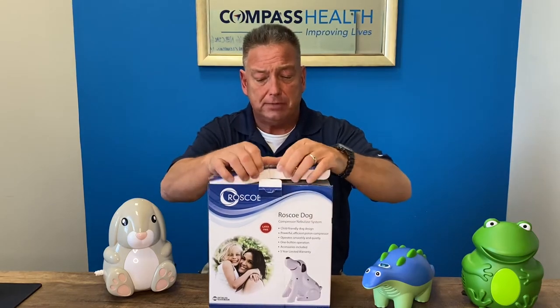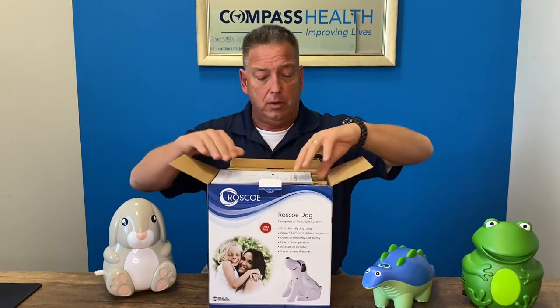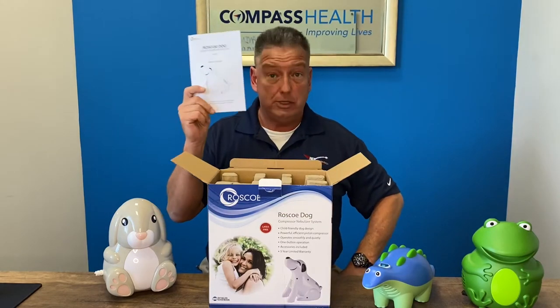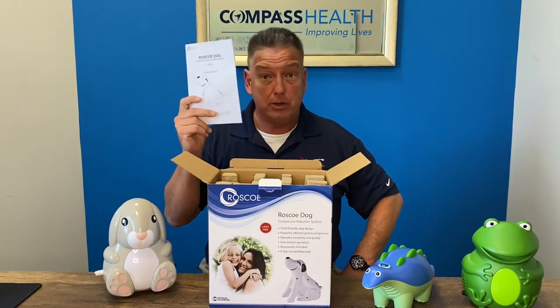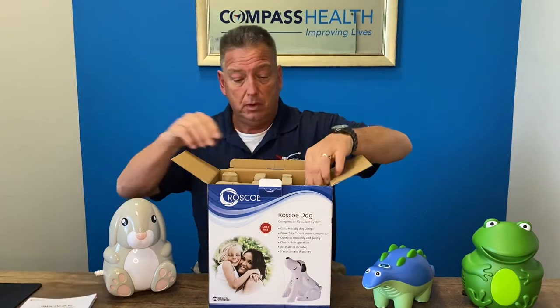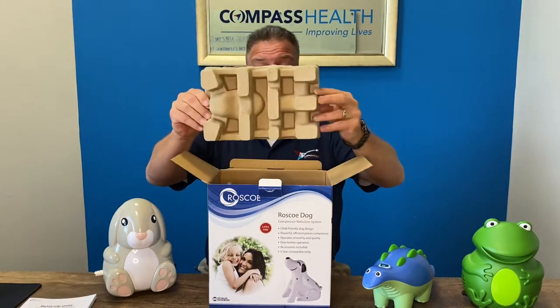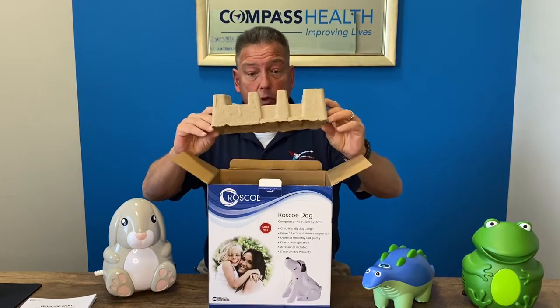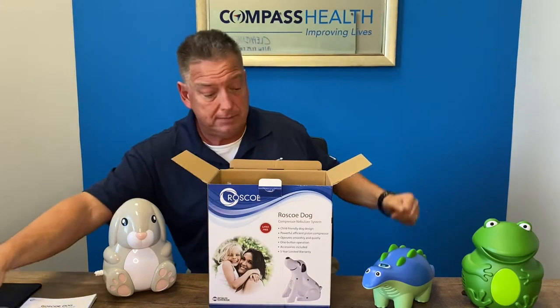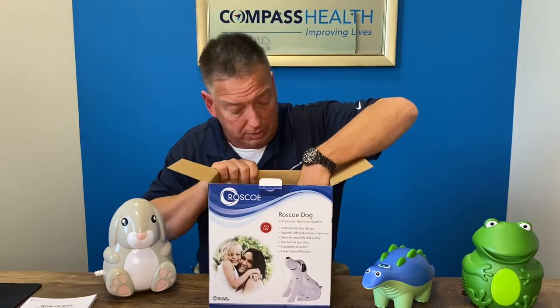So first we'll unpackage it. And as always, the owner's manual is right on the top. Always read this thoroughly prior to using the unit — very important.